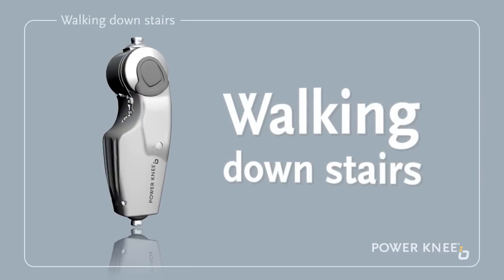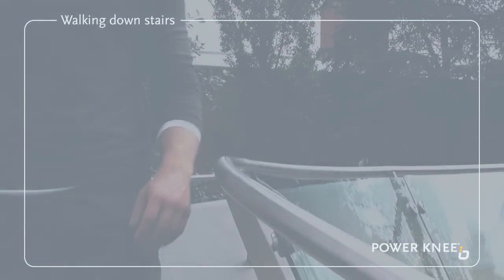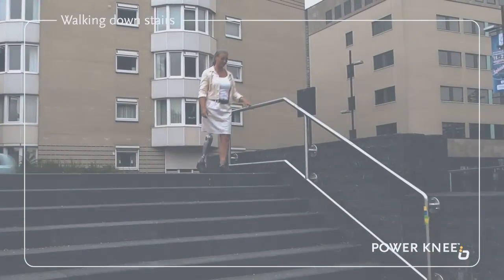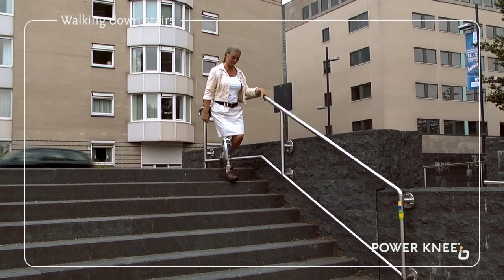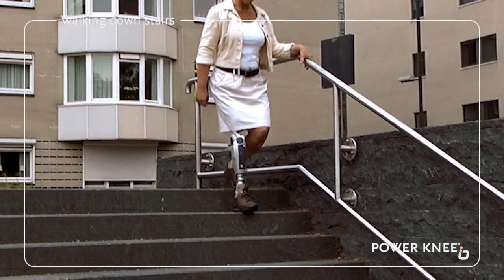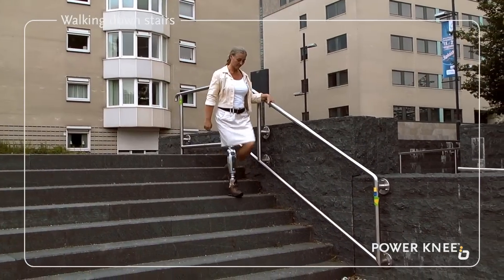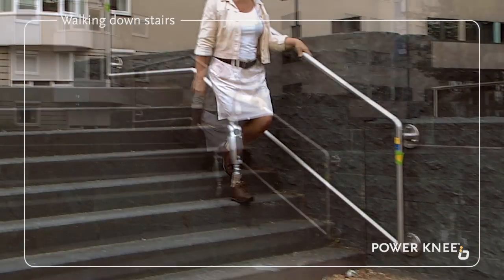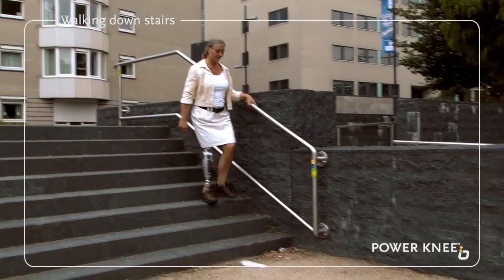Walking downstairs. We recommend you always use a banister or handrail when walking up or down stairs or slopes. Take your first step down with the Power Knee and make sure you transfer your weight onto it. It helps to lean backwards slightly, as this movement can help the knee to bend more easily. Continue descending the stairs at your normal pace, ensuring whenever possible that you place half your foot onto the lower step to give consistent support when walking down stairs.